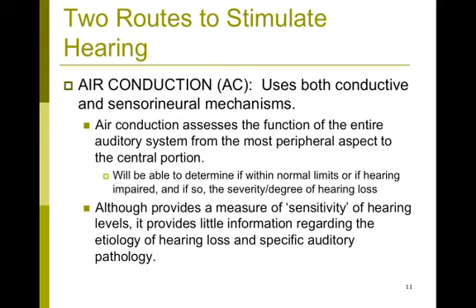And when we're doing air conduction testing, we'd be able to determine if a person hears within normal limits, and if not, then we would be able to quantify how much of a hearing impairment he has. Okay, in other words, we'll be able to determine the severity or the degree of the hearing loss. However, when we're doing air conduction, we are measuring only the sensitivity of the hearing apparatus. It doesn't provide us any information about the etiology or the cause of the hearing loss.